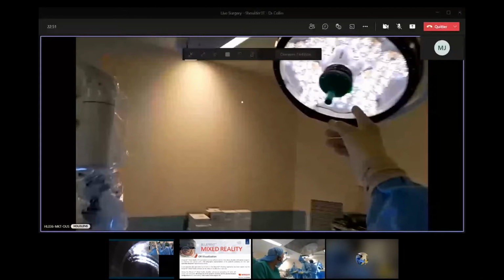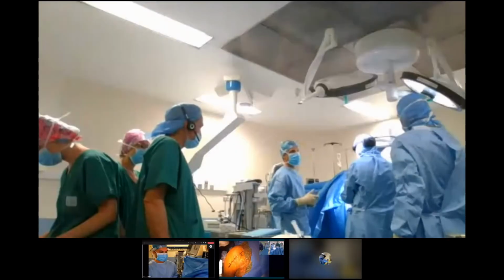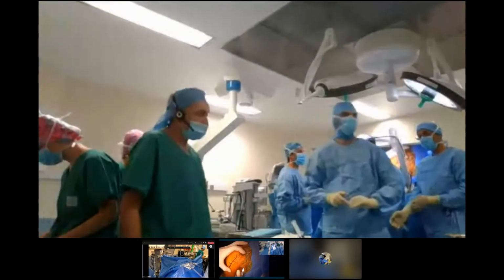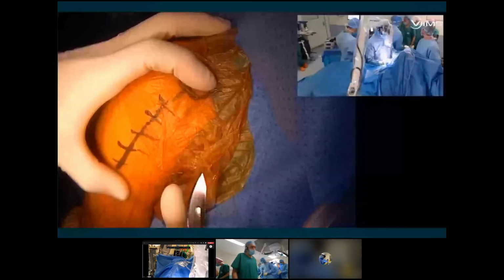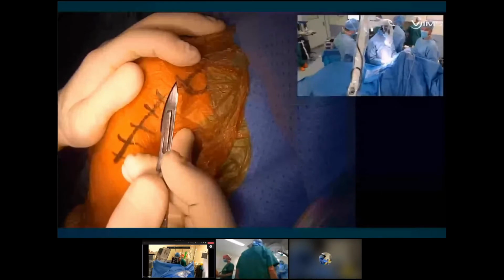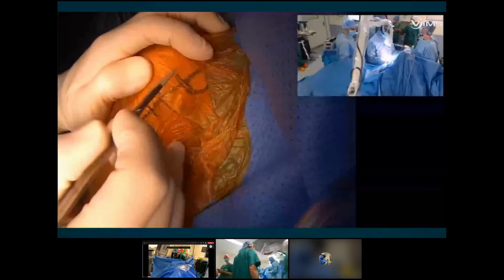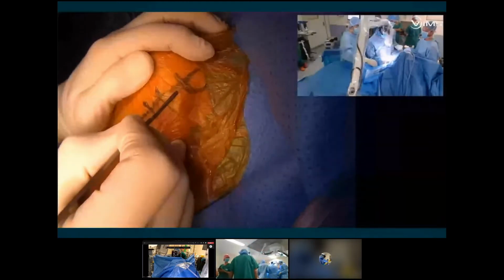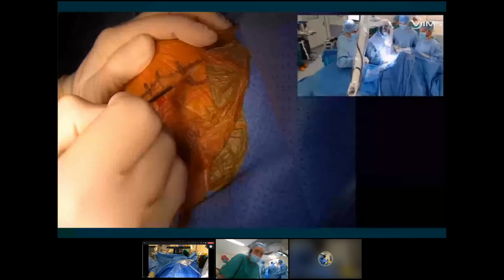So you can start maybe? Okay. You need to make a checklist or it's okay? Checklist is okay. So it's the right side. I can start? He's a good patient. You can start. Okay. Incision. So it's a deltopectoral approach, regular one, nothing special.